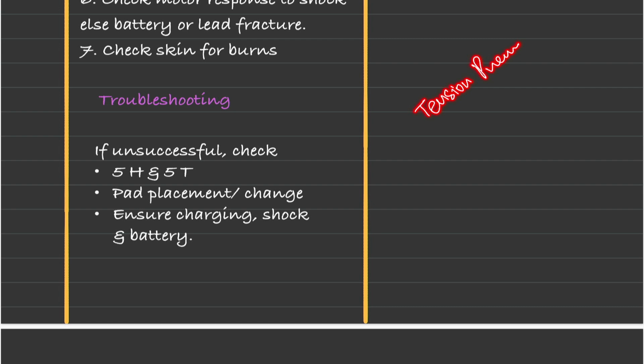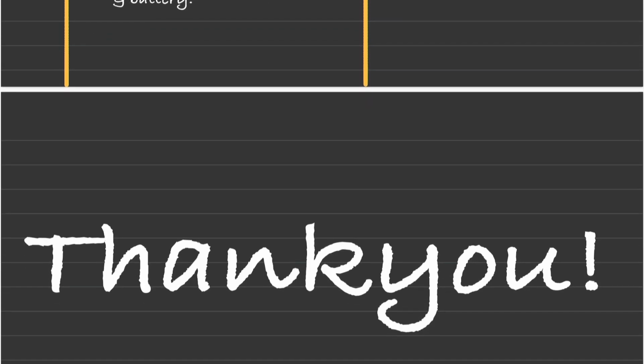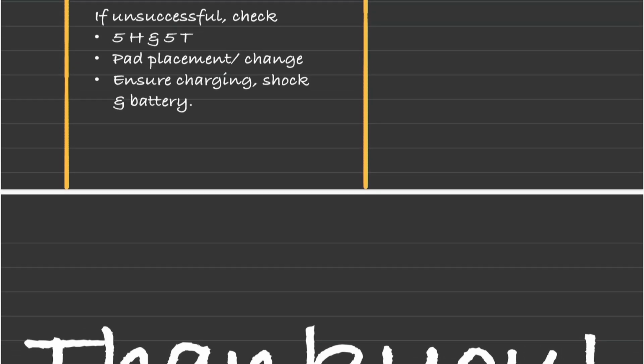We have to rule out tension pneumothorax, we have to rule out toxins, we have to rule out coronary thrombosis, we have to rule out pulmonary thrombosis, and we have to rule out cardiac tamponade. So we have to see the 5H and 5T, and we have to ensure that the pads are placed in the right position, and they are changed if they are expired.